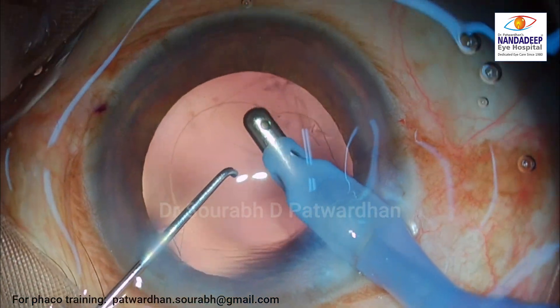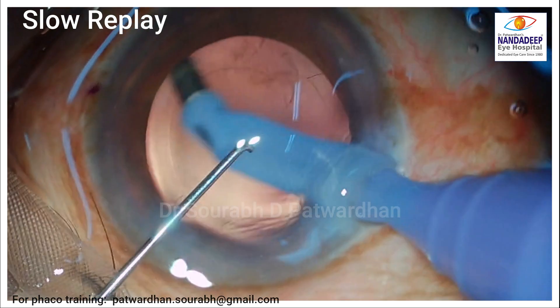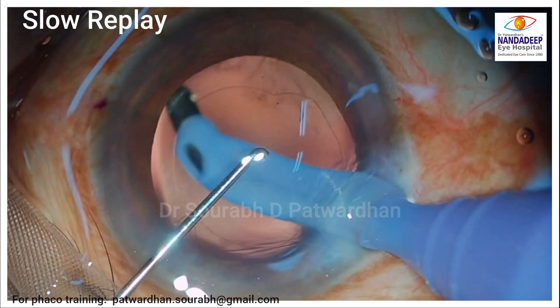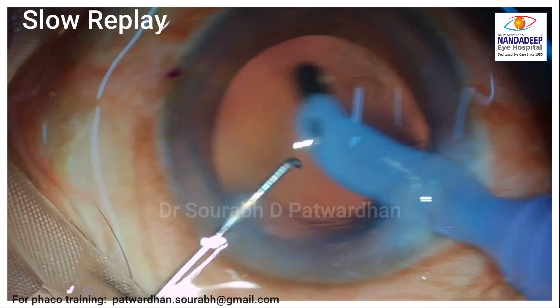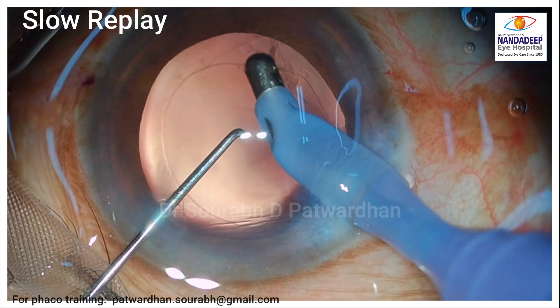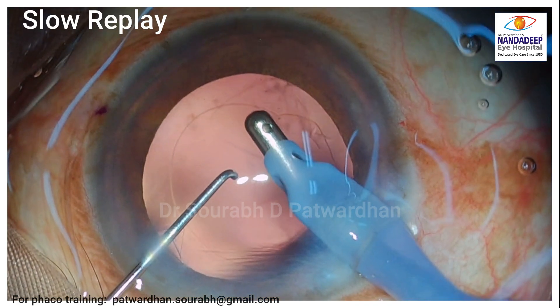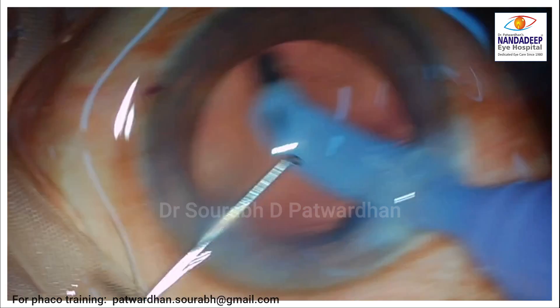Let's have a look at it again in slow motion. You can see the opening of the IA probe is on the side, facing towards the capsule. I was probably using higher vacuum than what is generally used for capsular polish — I was using the settings for cortex aspiration and didn't shift to polish mode.